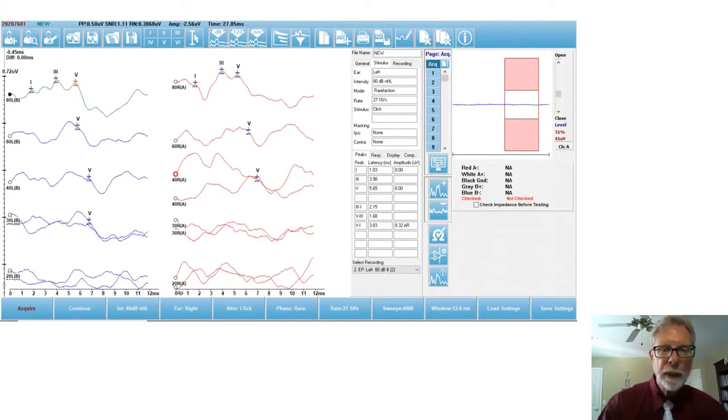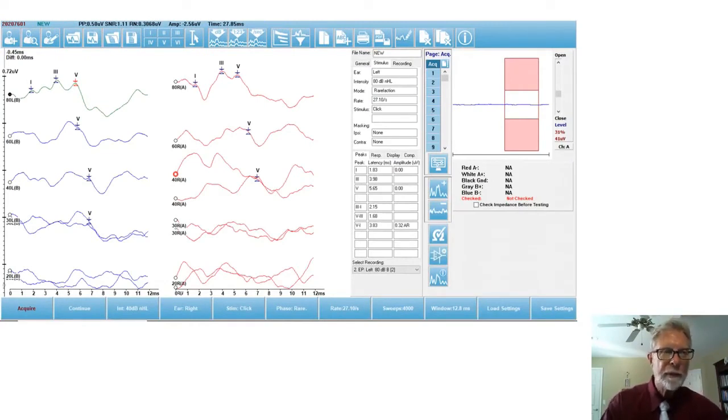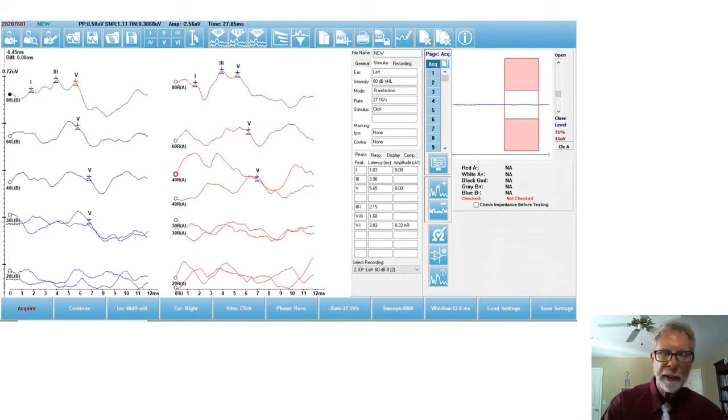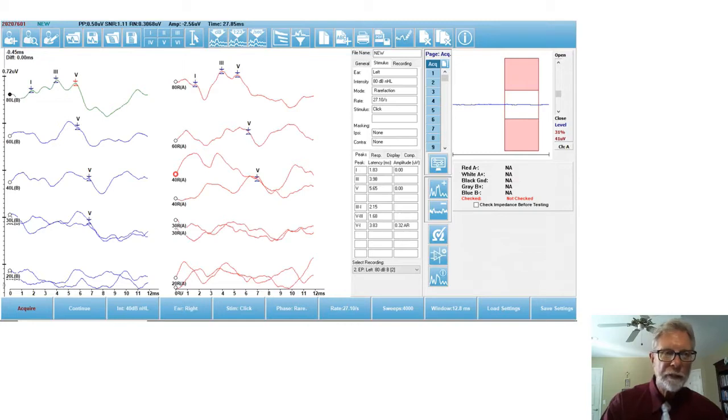Once you enter the patient demographics, and that's as comprehensive or as simple as you want it to be, and of course you would want to enter their age and their gender because it has norms built in.